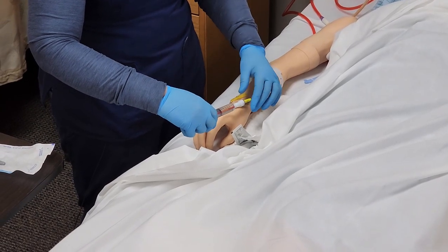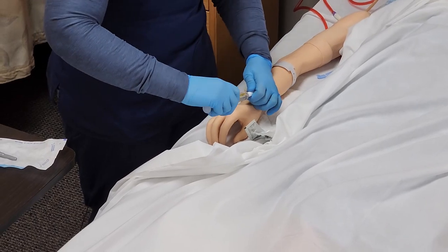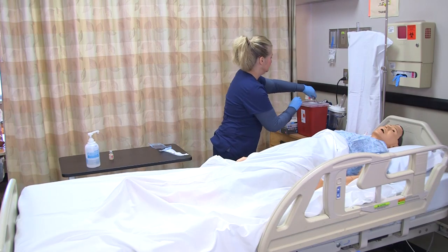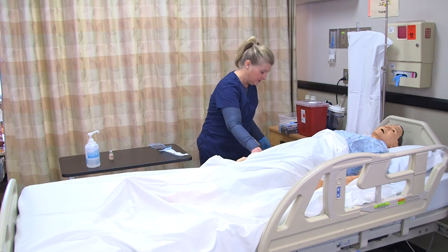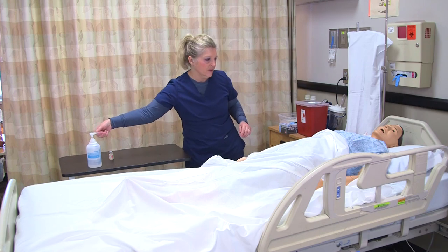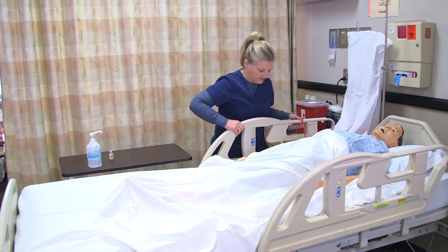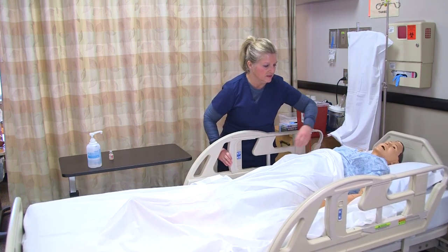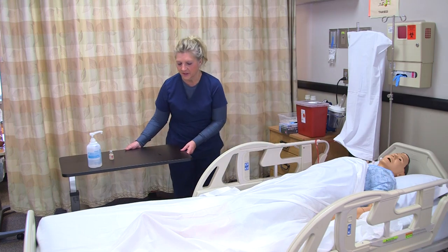Once the flush is in at the prescribed rate, I'm going to clamp and remove my syringe. Then I'm going to lower the bed, put the side rail up, and put the patient in a comfortable position. Culture of safety: bed locked and lowered, call light within reach, and tray table by the patient.